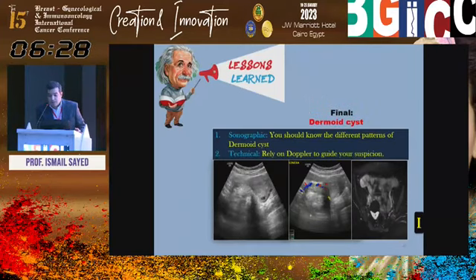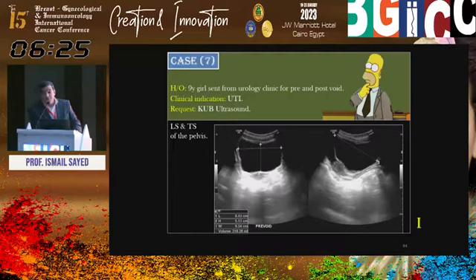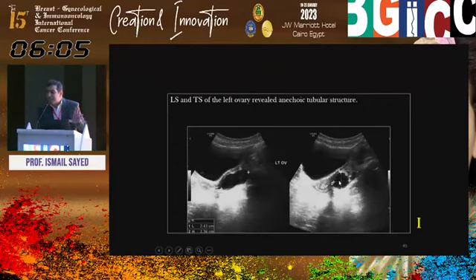Okay. Another case. I'm looking at the time. Yes. 9 years old, presented from the urology clinic because she has a problem with urination. Please, Mr. Radiologist, measure the urinary bladder before and after voiding. Okay. What else? Incidental finding: the left adnexa contains a cyst, maybe functional, at 9 years old. It's okay. But is it a simple cyst or?